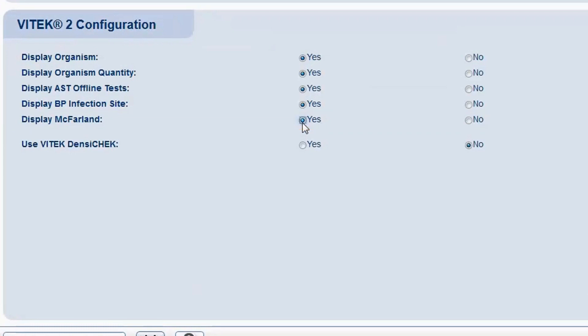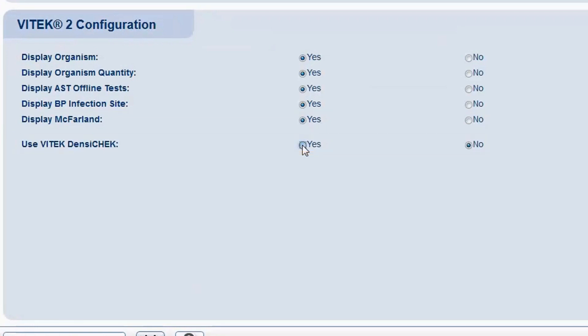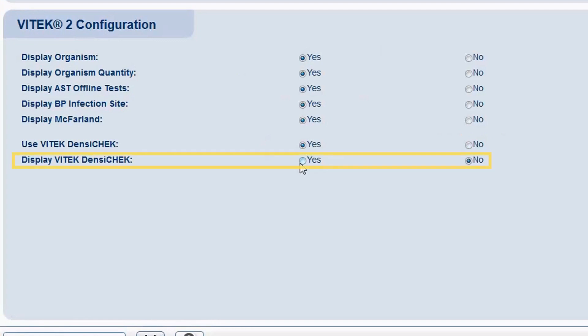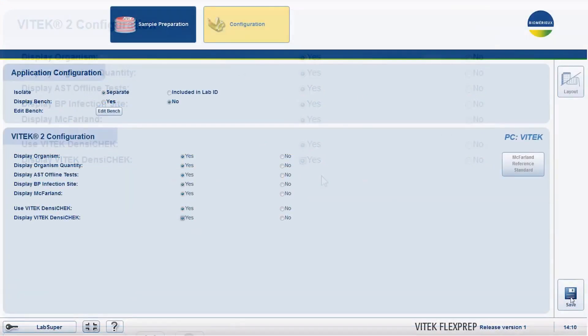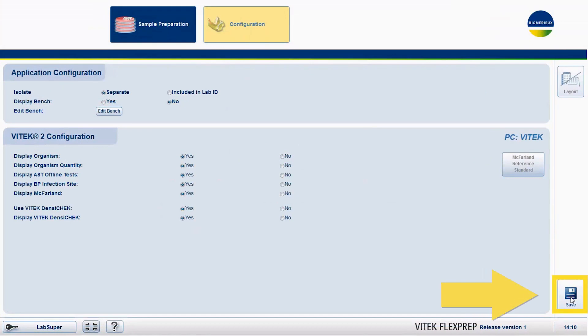Select Yes for Use Vitek Densichek, and if desired, select Yes for Display Vitek Densichek. Click the Save button.